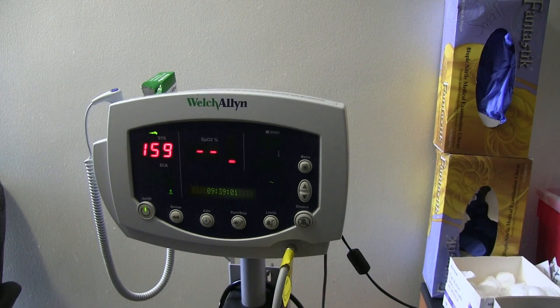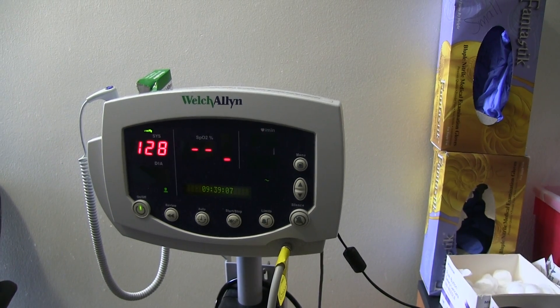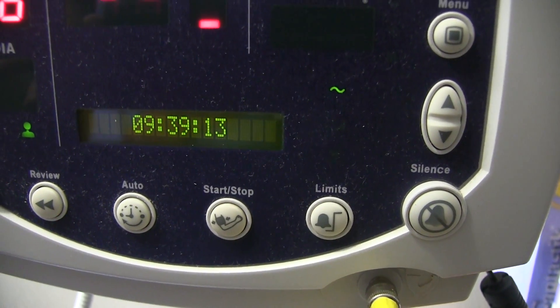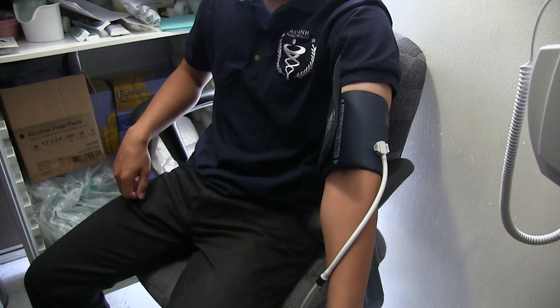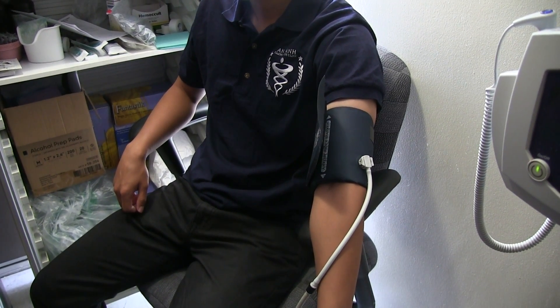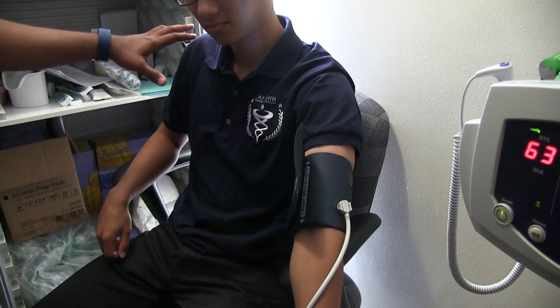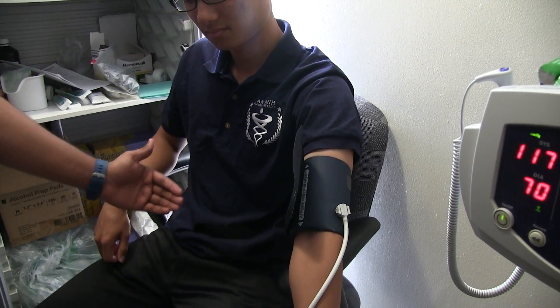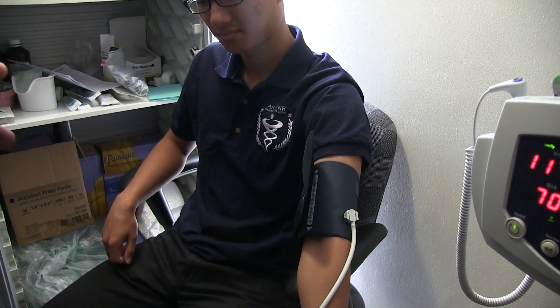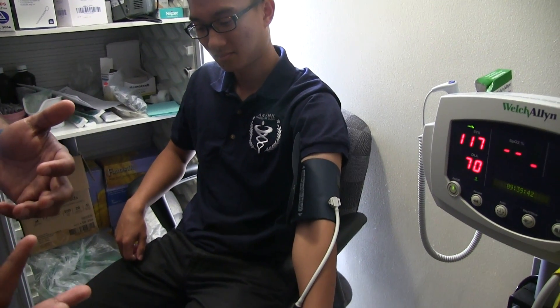While this process is going on, you also measure the respiratory rate. Look at the clock and count how many times the patient breathes in 15 seconds, then multiply by four. Getting the respiratory rate is a little tricky — just observe the patient. Sometimes you'll see their shoulders move up and down slightly, or their abdomen moves in and out. Usually it's about four or five breaths per 15 seconds, then multiply by four.